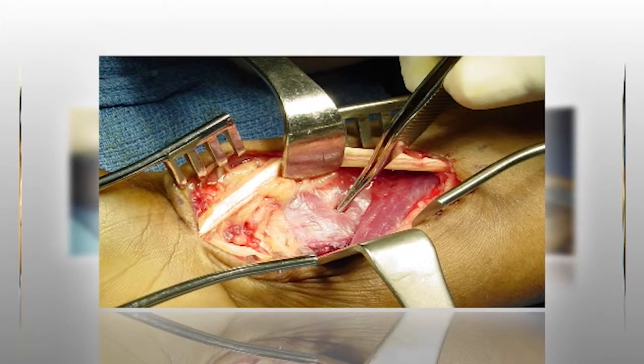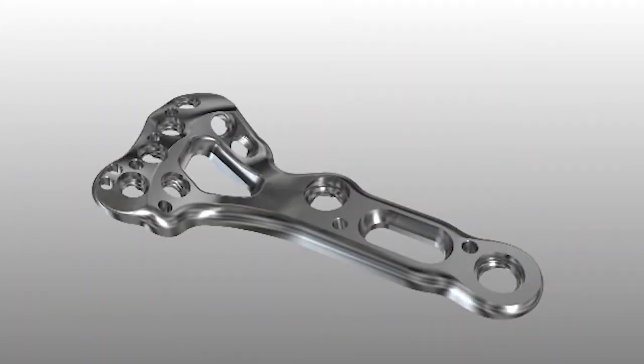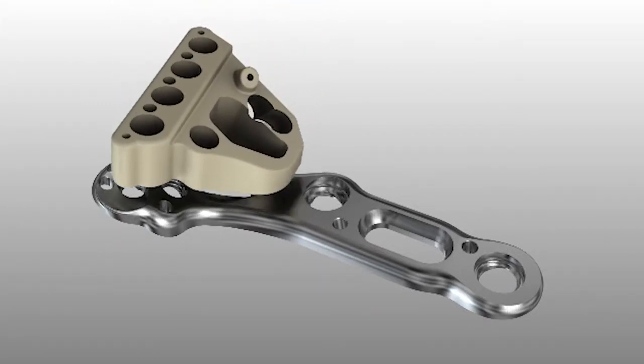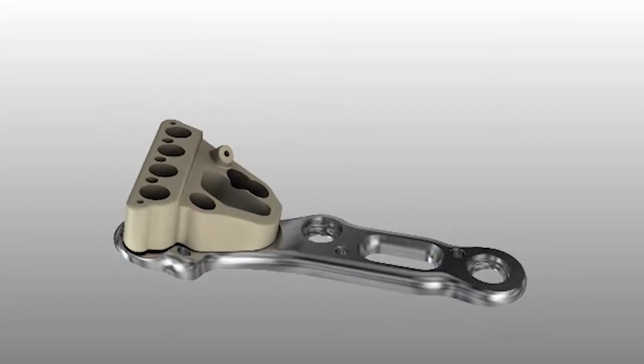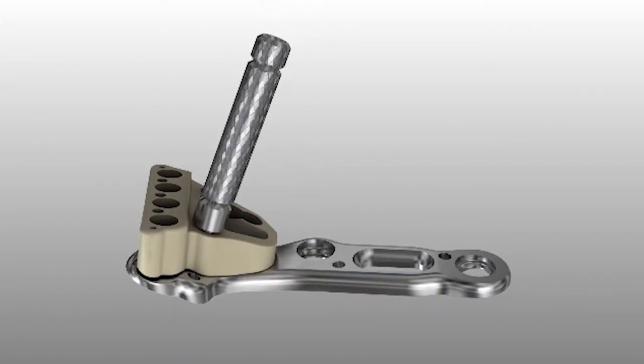The brachioradialis may need to be released from its insertion on the radial styloid to facilitate reduction and visualization of the fracture. Once the fracture is reduced, provisional stability can be achieved and evaluated under fluoroscopy. Once the appropriately sized VDR plate is selected, attach the corresponding targeting guide to the plate by threading the cannulated locking bolt into the proximal ulnar 2.3 mm screw hole.